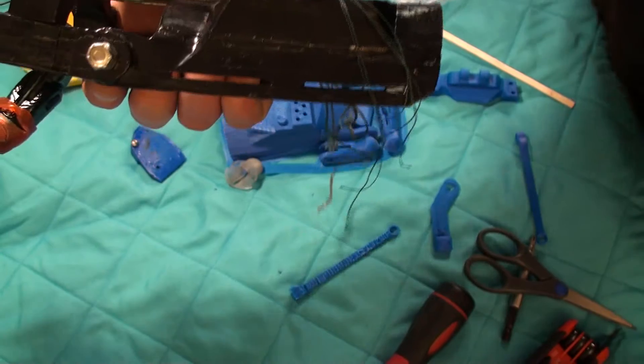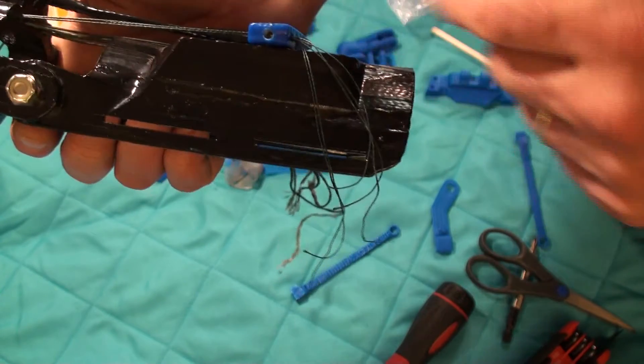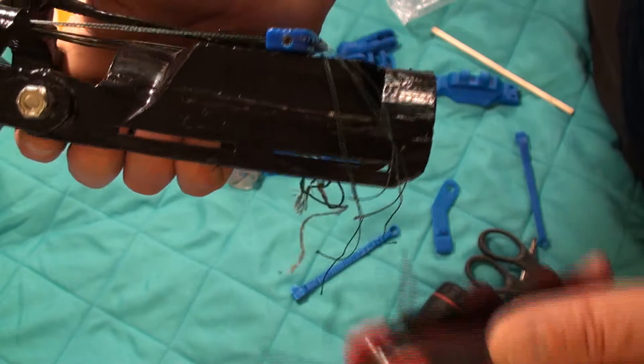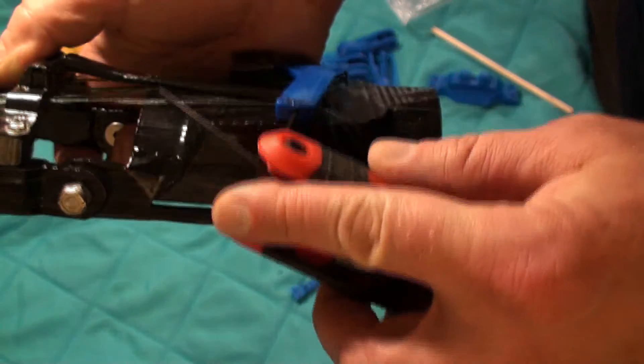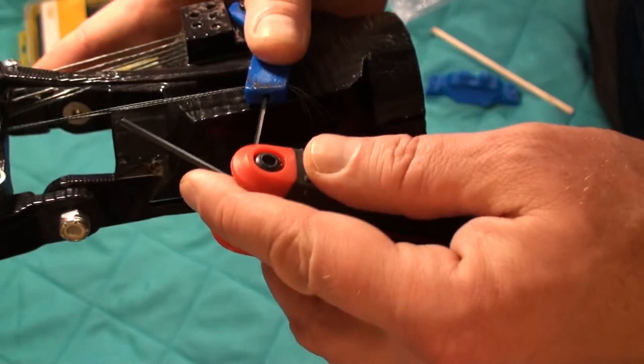On a 160% build, I found that an 8-32 — so a slightly smaller set screw — fits in there well.